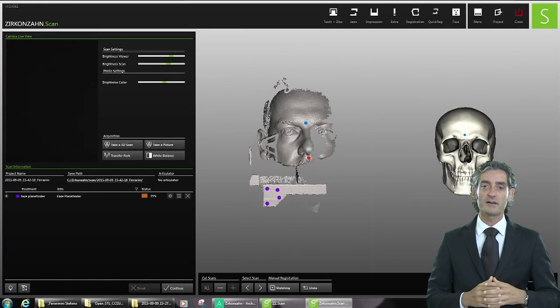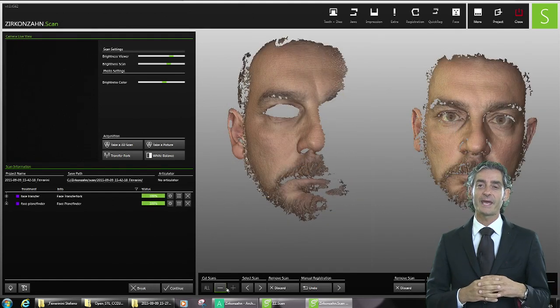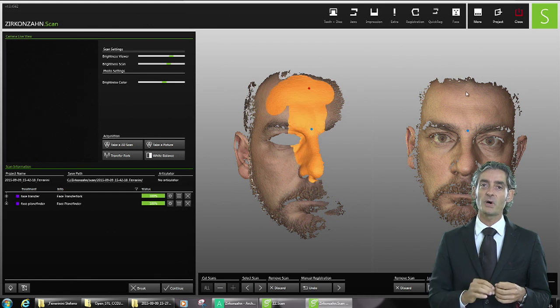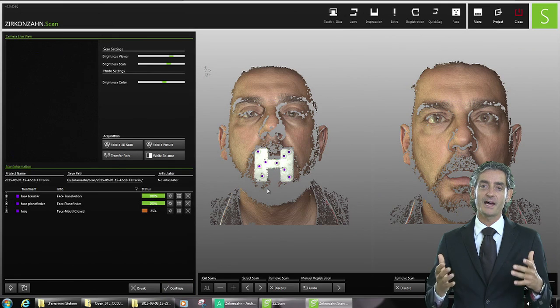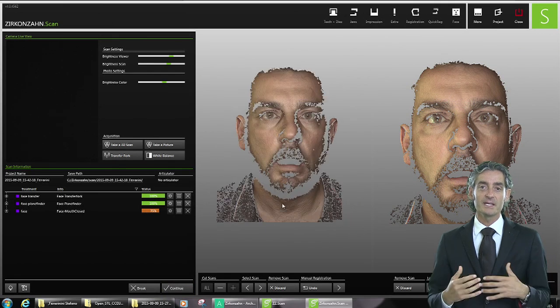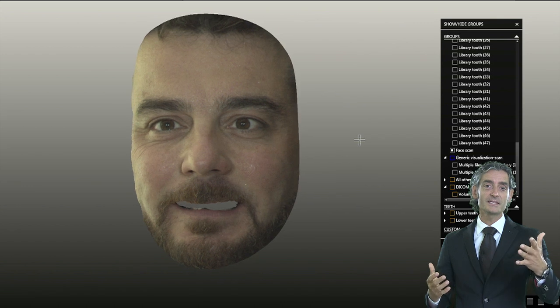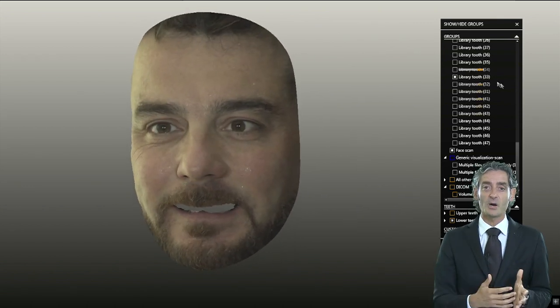As you can see here, after I take this kind of photo, I can match together, finding the precise position of some points and superimposing one picture on the other. And then what I have is a patient that can be in rest position, in smiling position, and this is what we can have, a three-dimensional patient inside our computer.